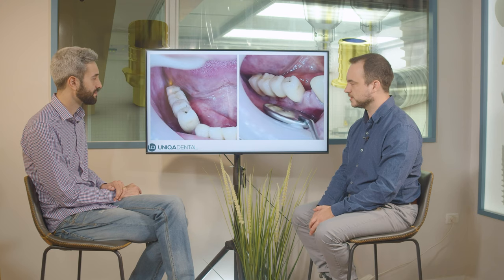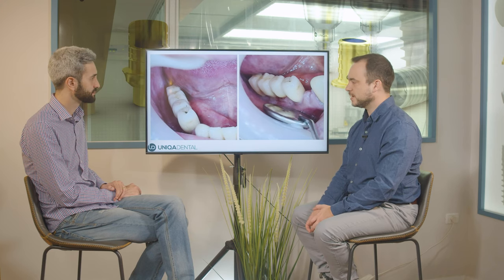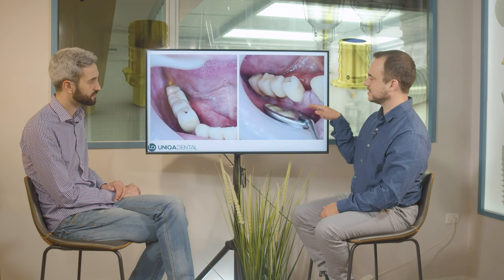It's a four-unit bridge on four implants, a cemented restoration — a PFM bridge. The patient lost tooth number 44 with time — the tooth that's supposed to be here.